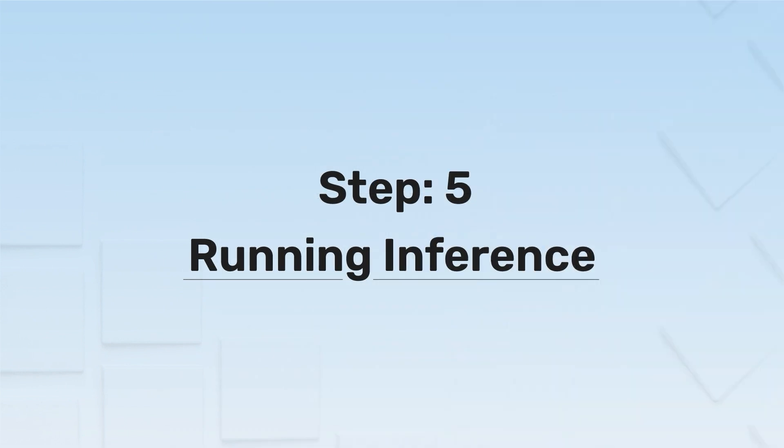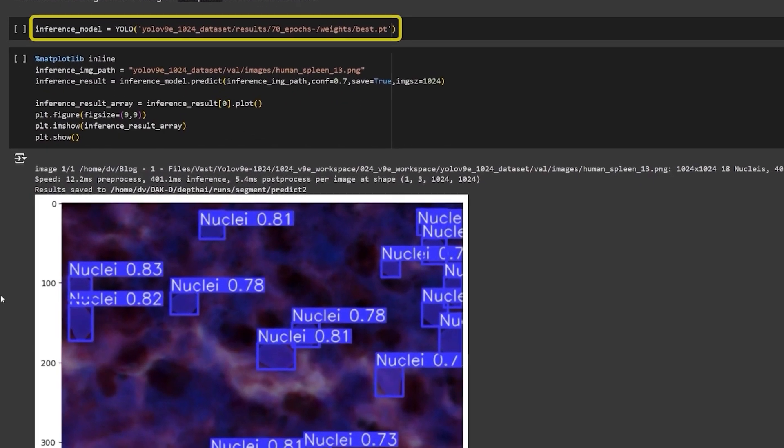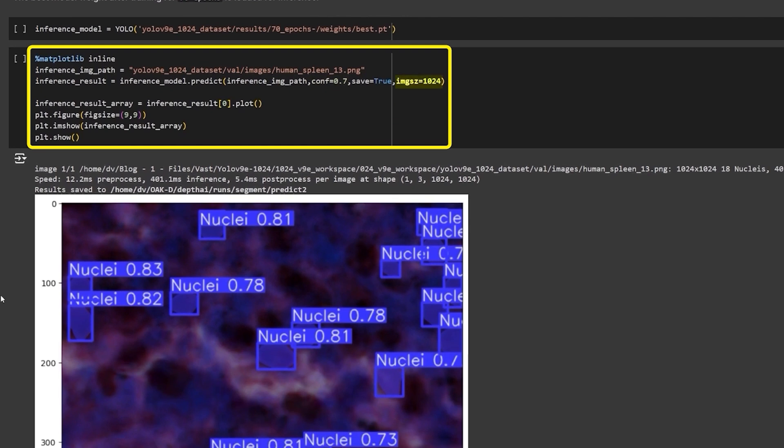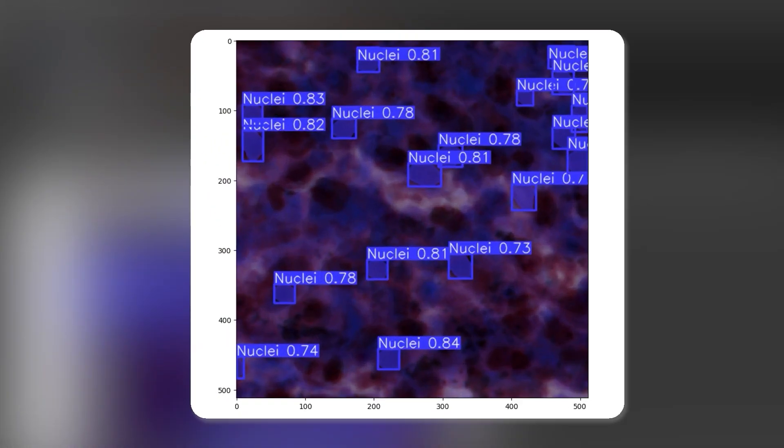Step 5. Running Inference. To run inference, load the model with the best weights and then call model.predict and pass the image, the confidence threshold and the input image size. Use save equals true to save the prediction to disk.